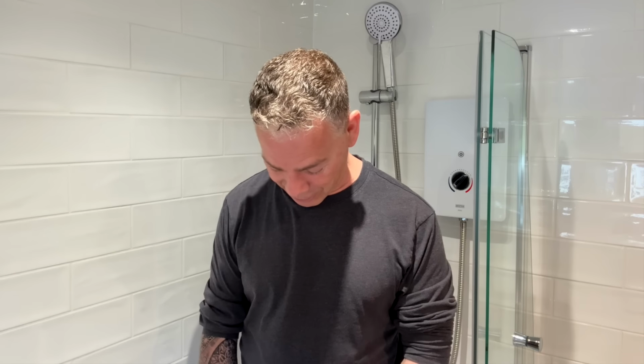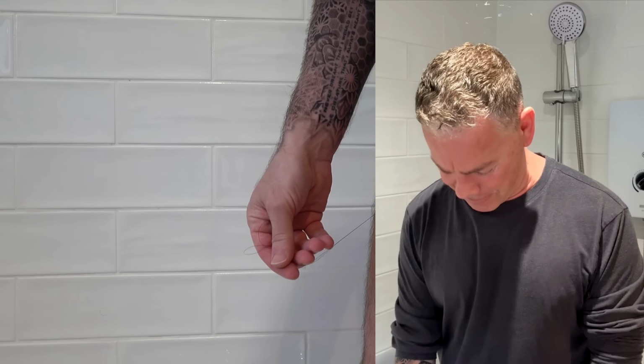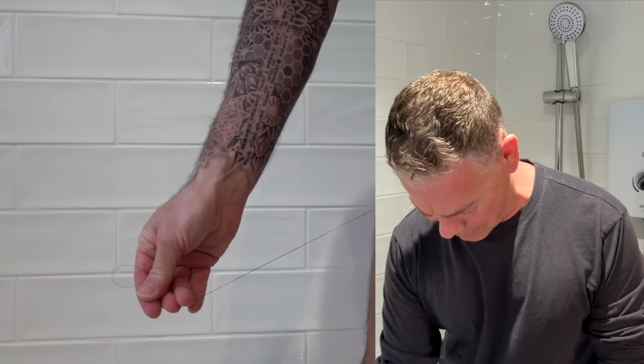So apparently I have to take a hold of that. And then it says relax, take a deep breath. I don't think that's going to cut it. I can feel my breathing is getting quicker, my heart is pounding already. And then what I'm supposed to do is just pull steadily, not forcefully and not too slow, and apparently it should slide out. Right. Oh my God, I am dreading this. Right, here we go then.